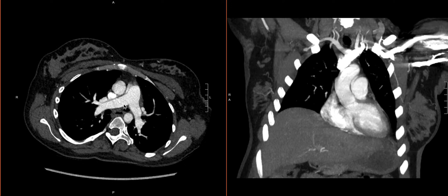The anatomy can be a little bit different patient to patient. Not everyone may have the same clear sense of where the lobar artery is. But regardless, what you should do is be very systematic about tracing things out, going proximal to distal, then tracing backwards, and making sure that you don't miss any pulmonary emboli that you can detect on your study.